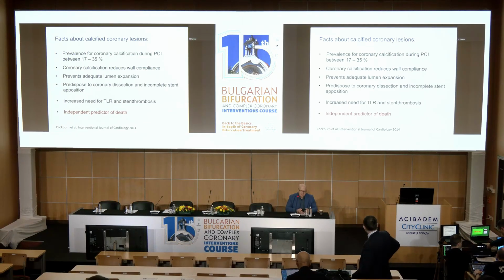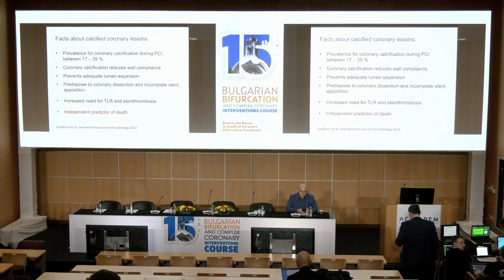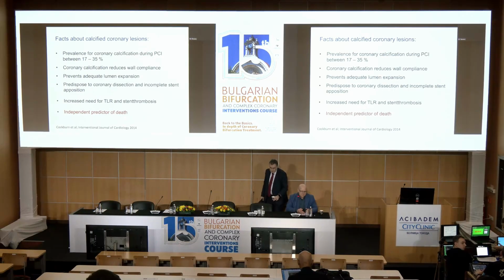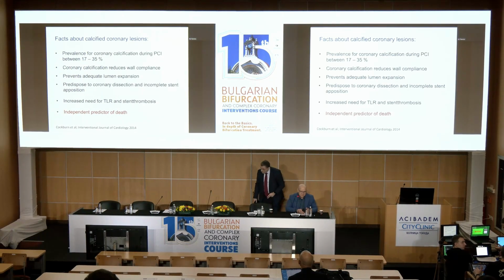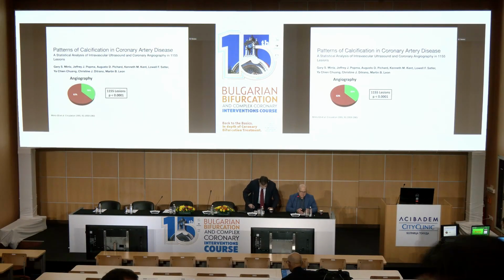The stent expansion is very difficult to achieve. You need much more pressure. And of course, you can cause dissection and even rupture of vessels. So long-term follow-up is associated with suboptimal clinical results. We know this from all the data, which Gary Mintz could demonstrate very nicely.